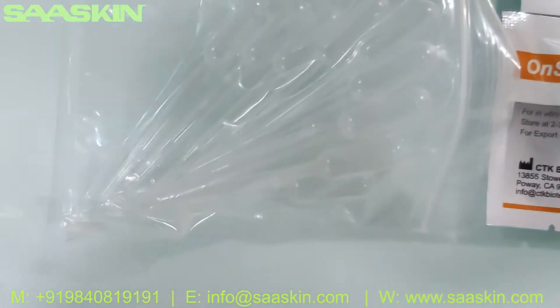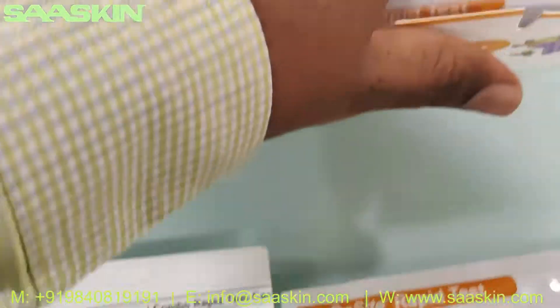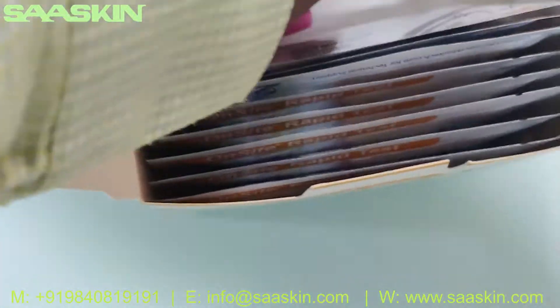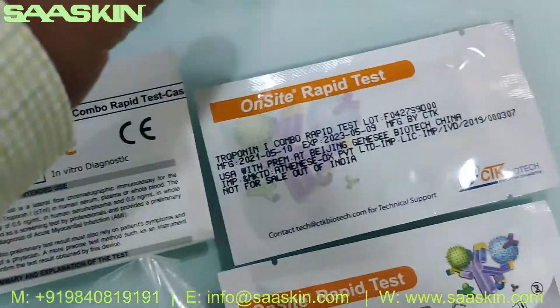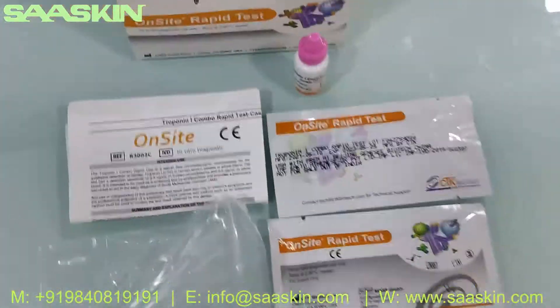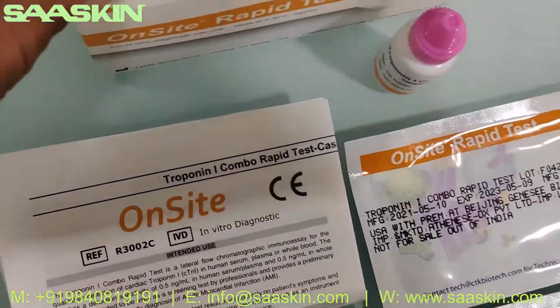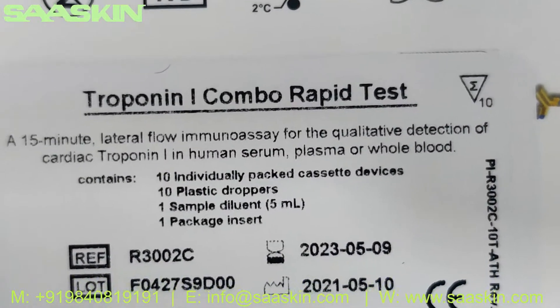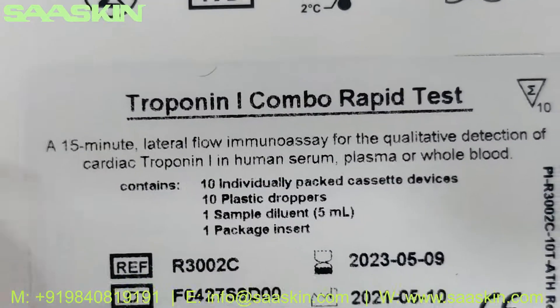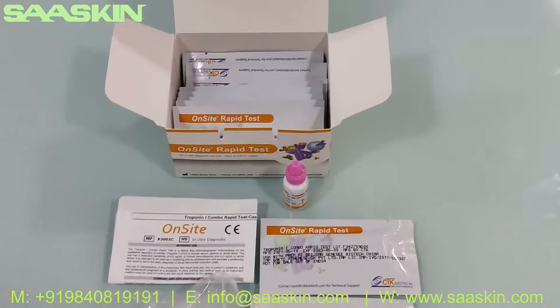You also have one buffer solution — the dilution buffer — in a 5 ml bottle. This is the total contents of the box. As it also says on the label, each box contains 10 individually packed cassette devices, 10 plastic droppers, one sample diluent, and one pack insert which is the manual.